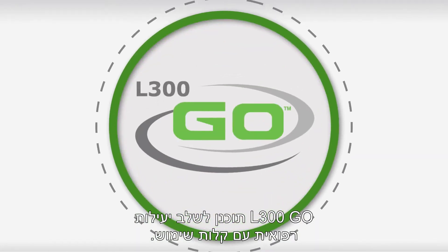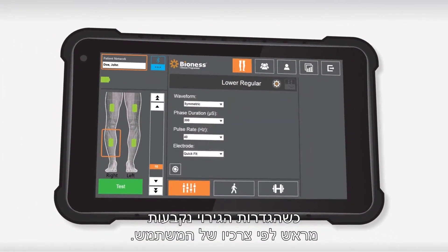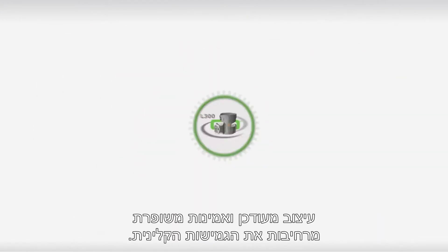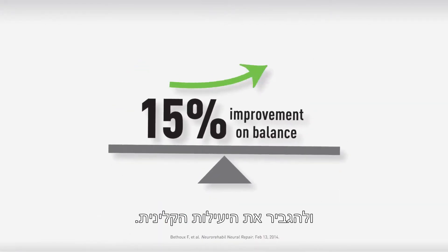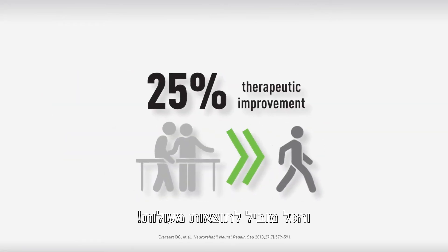L300GO is designed to combine clinical effectiveness with ease of use. Programming and setup are straightforward, with stimulation parameters preset based on user need. Updated aesthetics and enhanced reliability improve clinical versatility. Every innovative feature is designed to improve the patient experience and maximize clinician productivity, all resulting in superior outcomes.